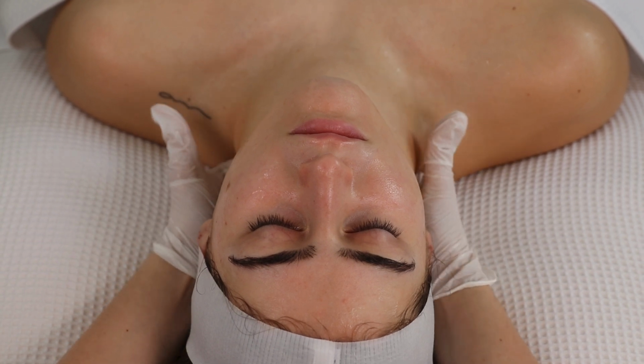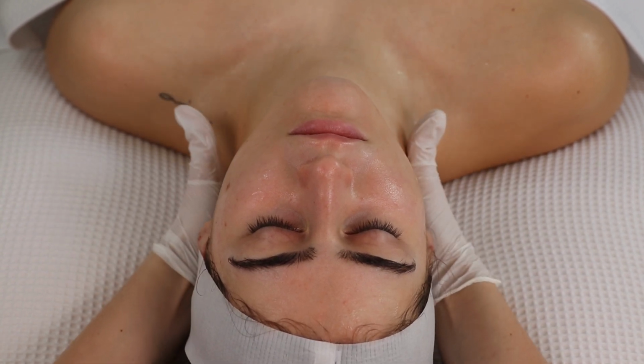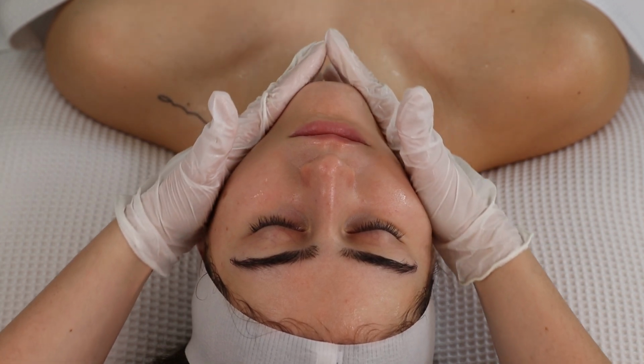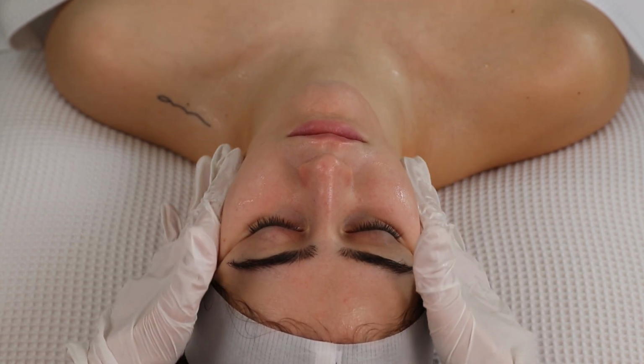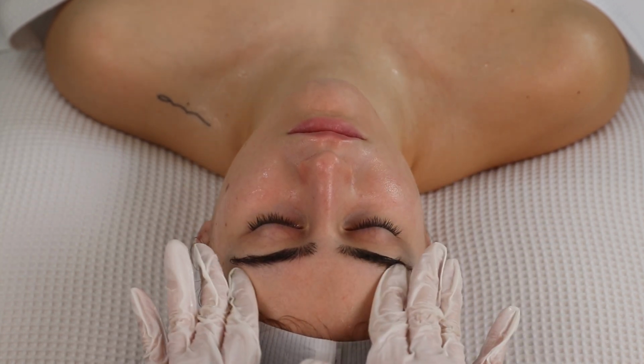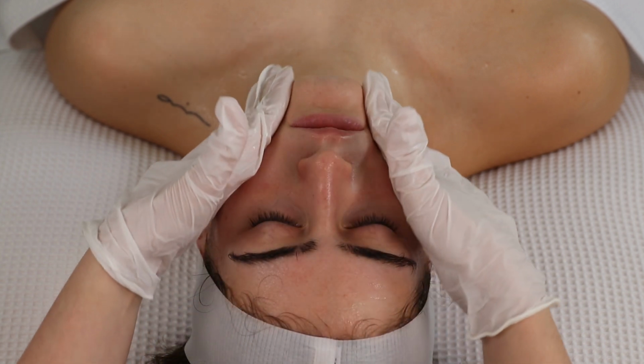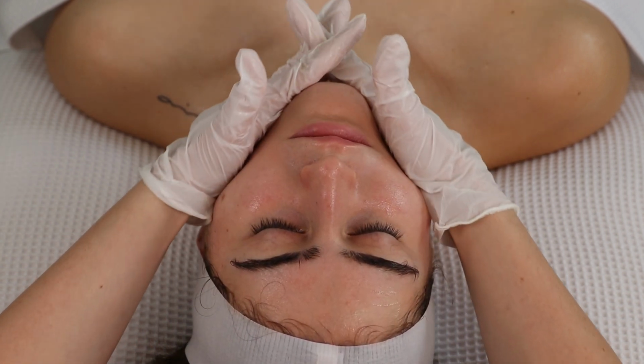Slide upwards towards the forehead and gently slide down, only using 2 of your fingers without applying any pressure. Use both hands to scoop up towards the forehead and glide down using 2 fingers.